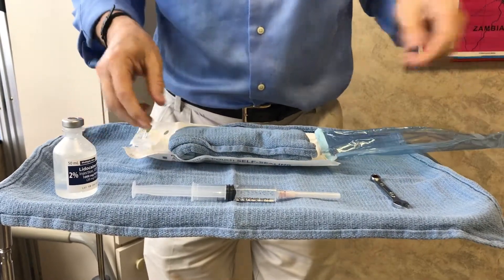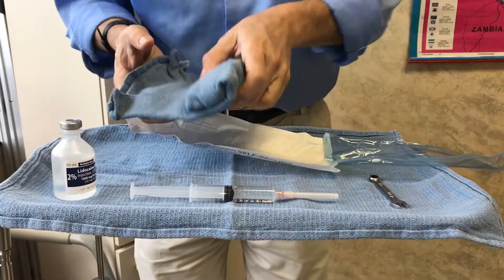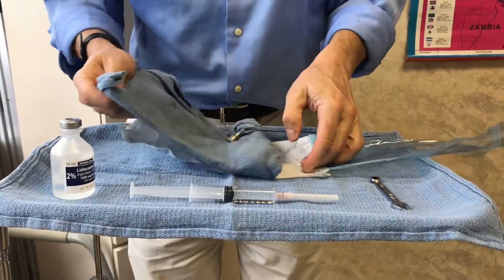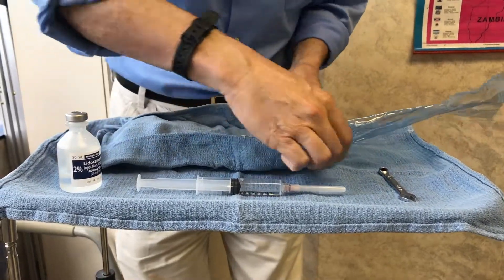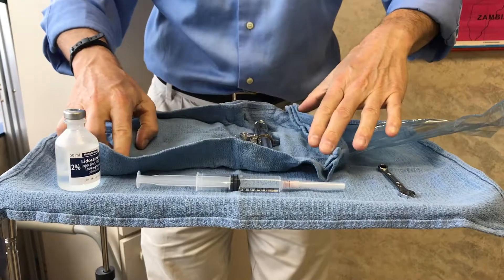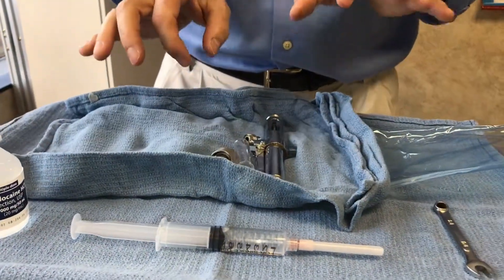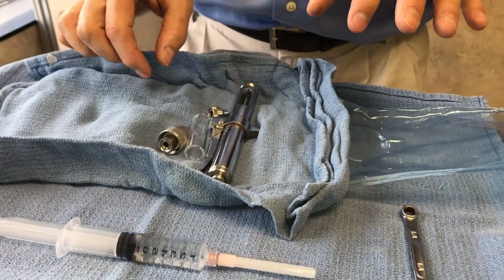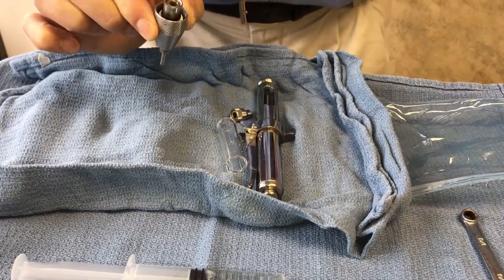We wrap it in a standard surgical towel. So we have all the component pieces here. This is totally sterile. As soon as I touch the outside, it will be non-sterile. So now this is non-sterile, but this side is still sterile.